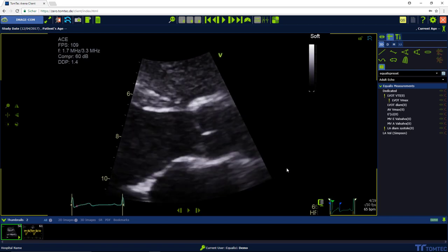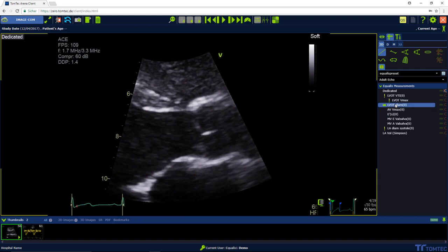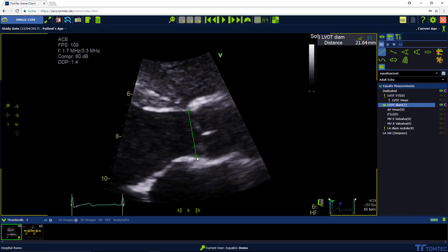Select the measurement on the right-hand side with a left mouse click, then move back into the image and perform the measurement again with two left clicks.